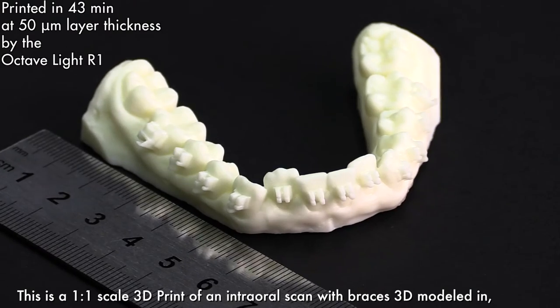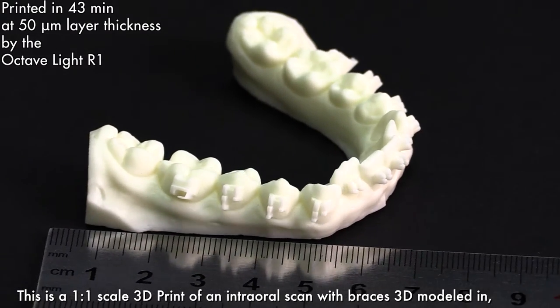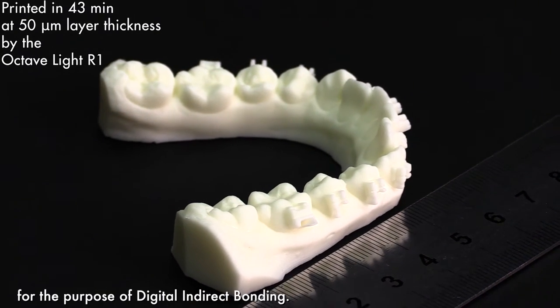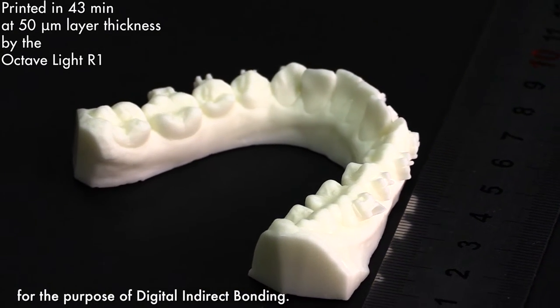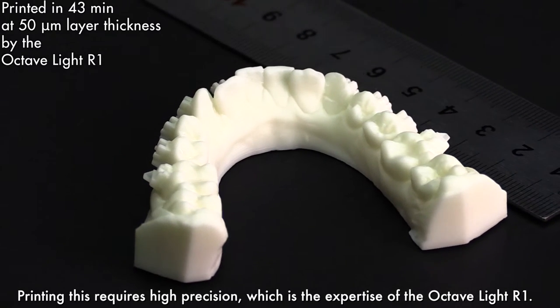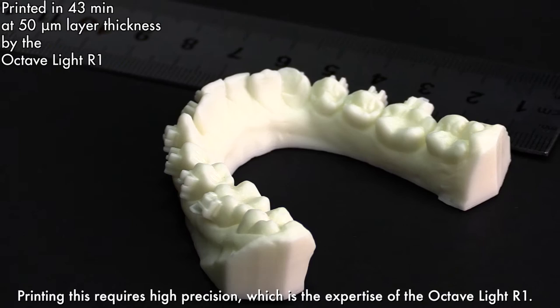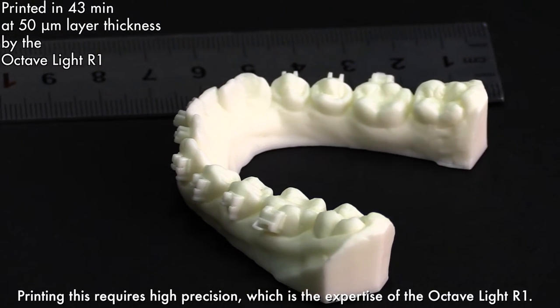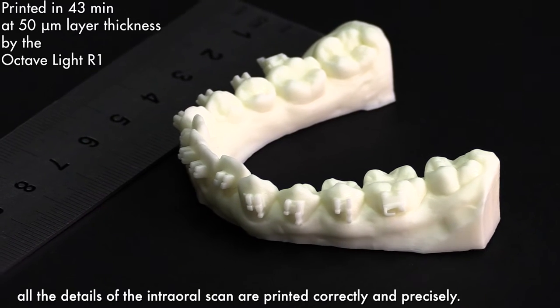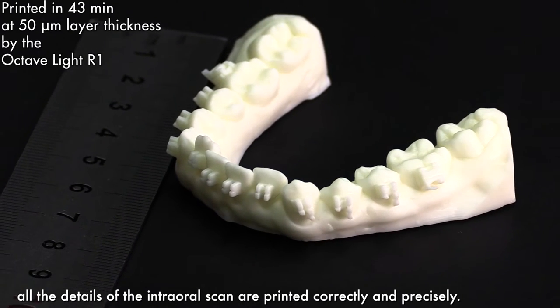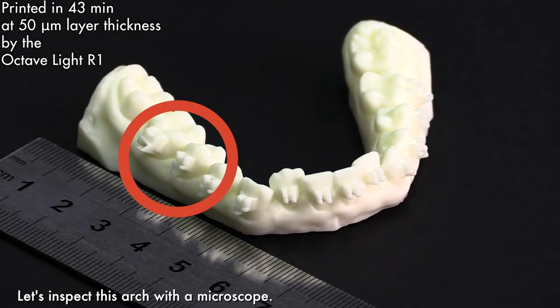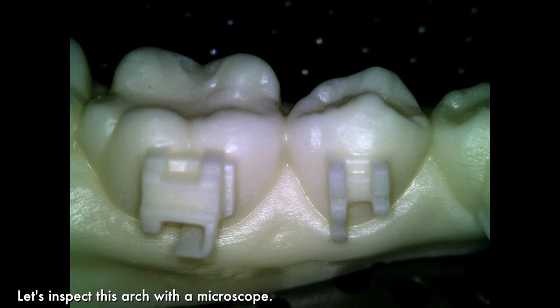This is the one-to-one scale 3D print of an intra-oral scan with braces 3D modeled in for the purpose of digital indirect bonding. Printing this requires high precision, which is the expertise of the Octav Light R1. Even with the high-speed printer setting, all the details of the intra-oral scan are printed correctly and precisely.